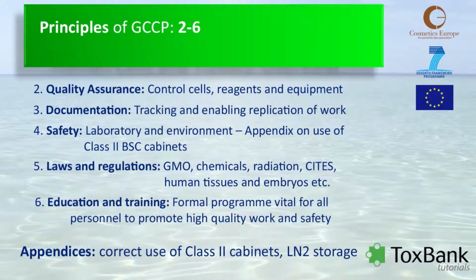And finally, there's also a section on education and training. It's very important to have a formal program for all personnel in the key procedures involved in cell culture to promote high quality work and safe operation. The appendices, as I've already mentioned, include one on use of biological safety cabinets and also a section on safe handling of liquid nitrogen and its storage facilities.